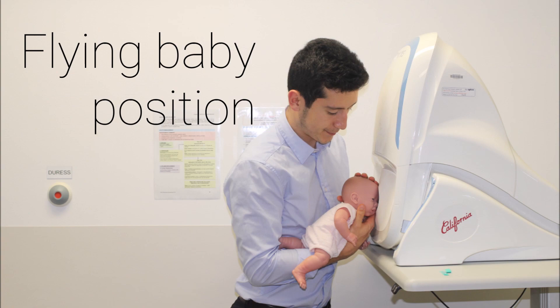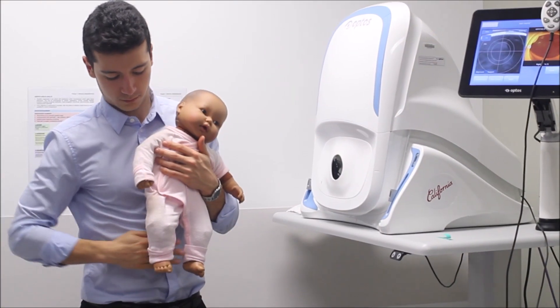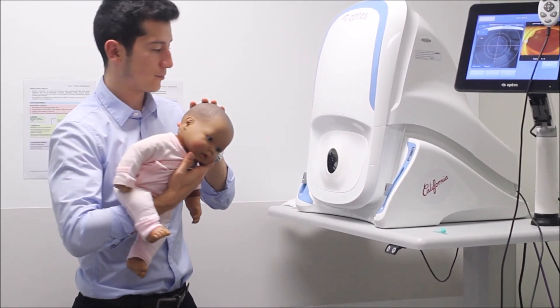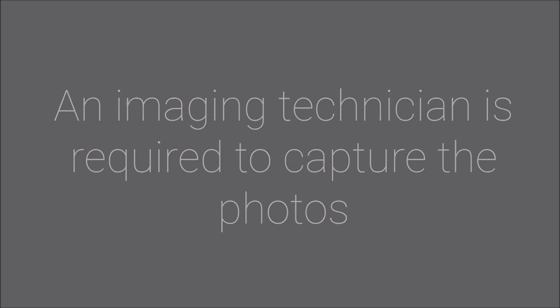Flying baby position — particularly suited to infants. Pass your dominant hand through the baby's legs and support the chest and chin area. Your other hand is placed on the occiput for stability. Guide the infant towards the camera's aperture whilst the imaging technician captures the photos.